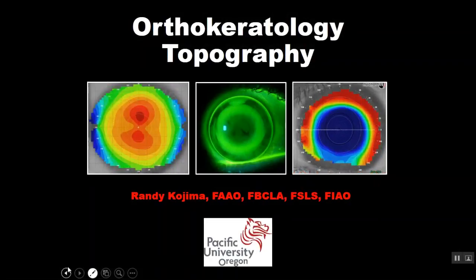Hello, my name is Randy Kojima, and it's my pleasure today to host this webinar on Orthokeratology Topography. Basically, what we want to discuss is how the topographer fits into practice, both pre and post-treatment, when we're fitting orthokeratology patients.